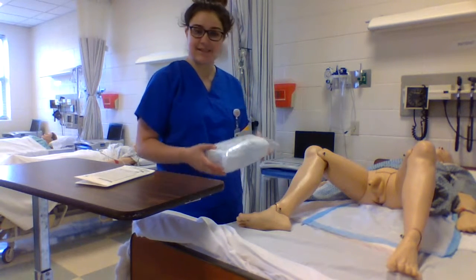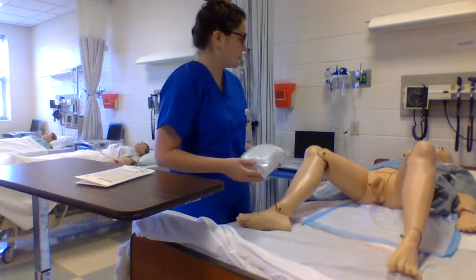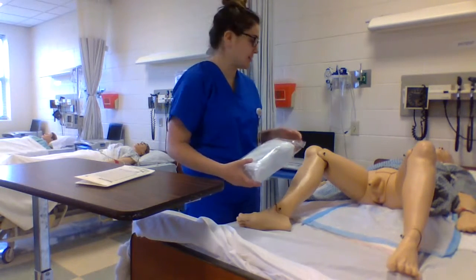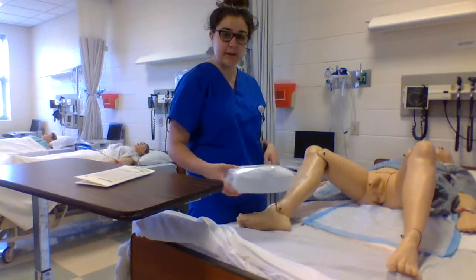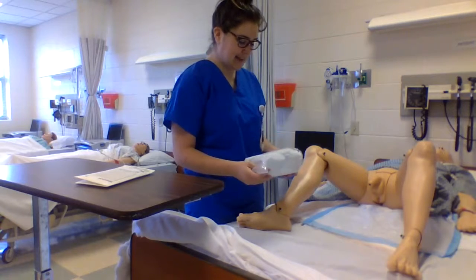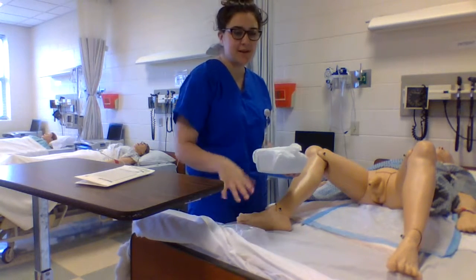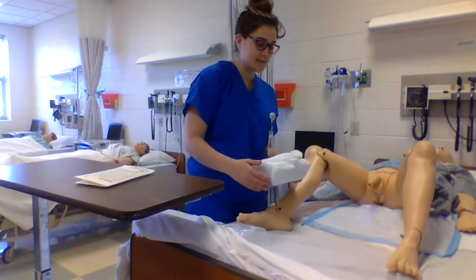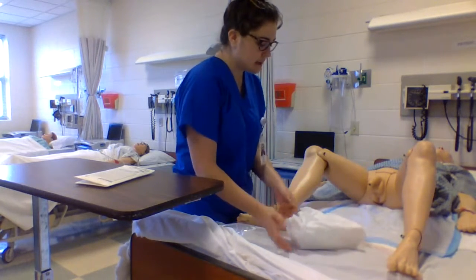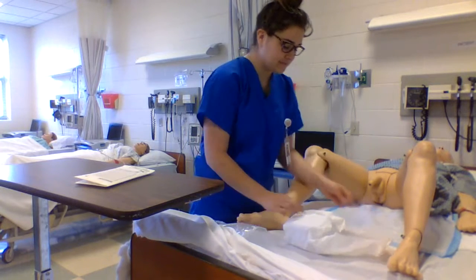I'm going to make sure this is intact and in date before I begin the process. I'm going to let him know that I'm beginning my process, Mr. Jones, which I've already explained to him. So I'm going to go ahead and open my cath kit. The trash is going to be at the foot of the bed, so it's out of my way. And I've got this for my sterile gloves. I'm going to place this where I need it, which is going to be away from me.